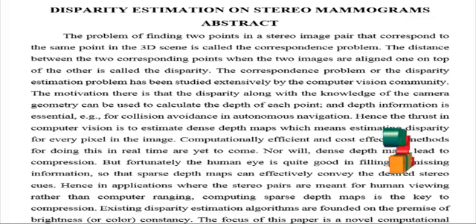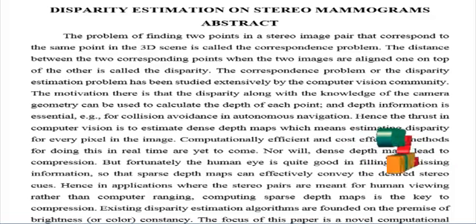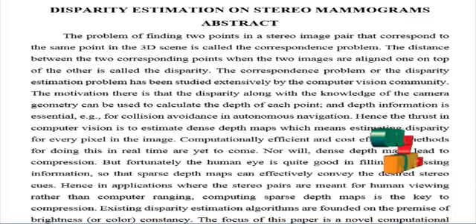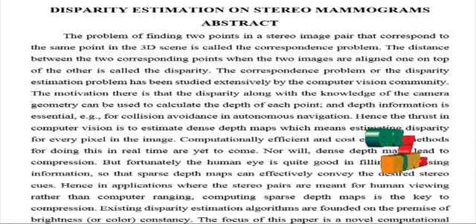The process can detect the location of impulse and edge singularities in the reference image of the stereo pair. The singularity index is used to de-emphasize smoothness and promote curvilinear structures in the disparity space.